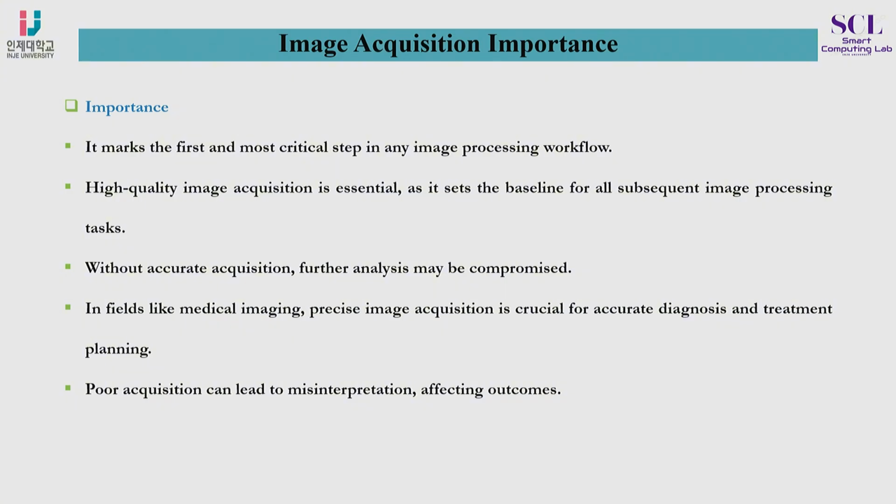So poor acquisition can lead to misinterpretation, affecting outcomes. Definitely, if the quality of the image is not good, then the model, for example, if you are using deep learning or machine learning, the output will also be overfitting, and it will interpret false results. And likewise, if the image quality is not good, and any physician is looking at your X-ray, he or she may interpret wrongly, and that will be a disaster.